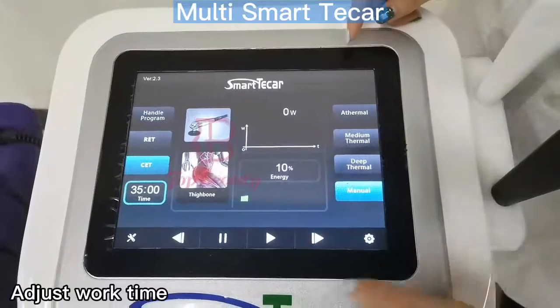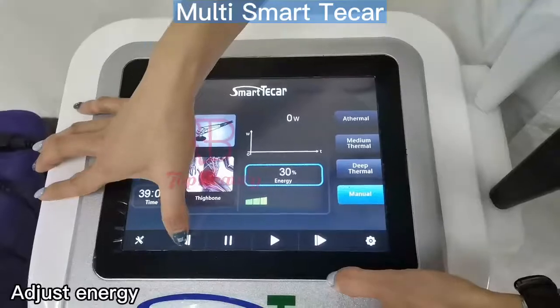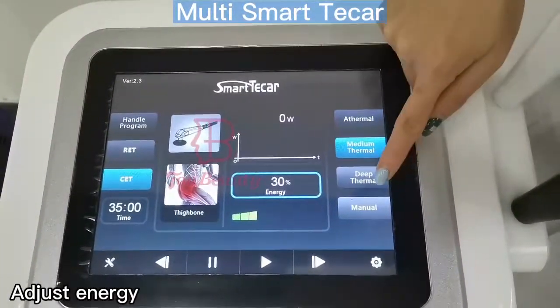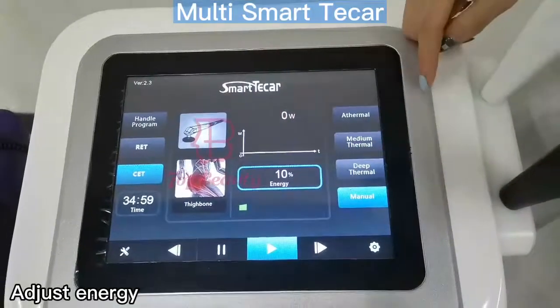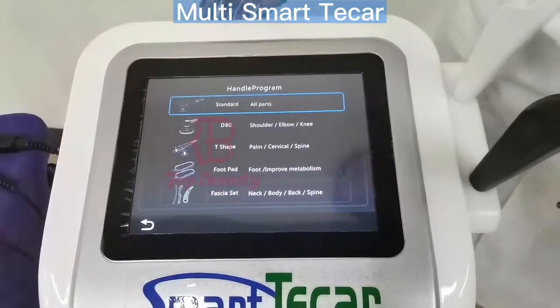We could also set the treatment times and the energy setting. It also comes with four different modes, and here are the slide buttons. For the RET it's the same settings, so let's go back to the home page.